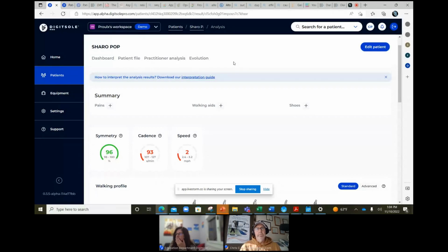So one of the reasons for using a locomotion analysis, and I've been doing this with patients for a little over 15 years, is, and it's my experience anyway, and we see some literature now that supports this notion, that we can actually use a locomotion, a walking analysis, to even sort of predict.